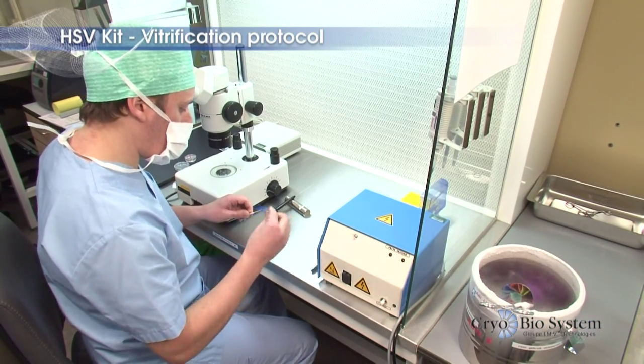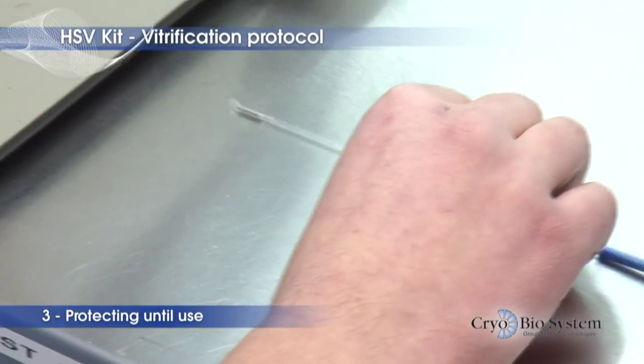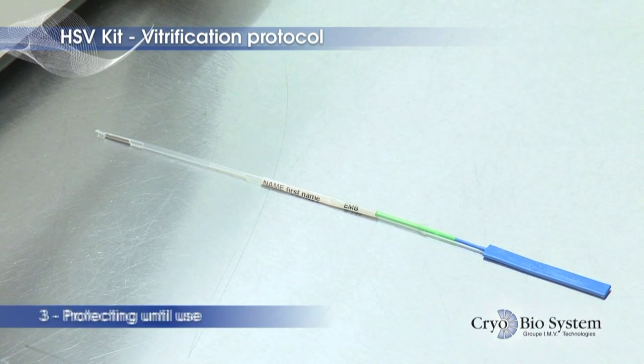Protect the coloured rod and capillary connected to the insertion device by partially inserting the gutter inside the straw until the kit is actually going to be used.